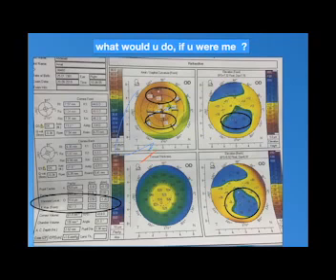Okay? Right, Dr. Okasha. It's the same with me, and you asked me about something like that. Second, the posterior elevation, which coincides with the inferior part of the cornea, is not high. So it's not expressed as a weak cornea or keratoconic topography. The same in the posterior and anterior elevation. There is minus, there is no plus, there is no protrusion.